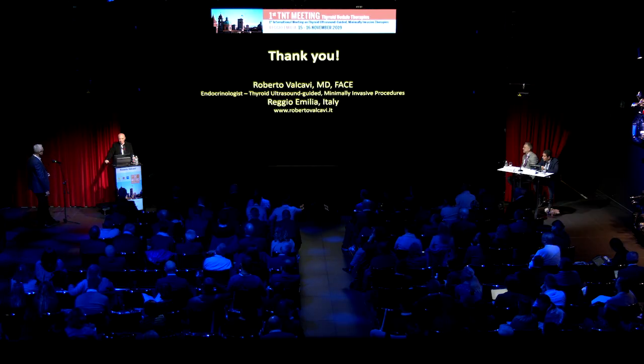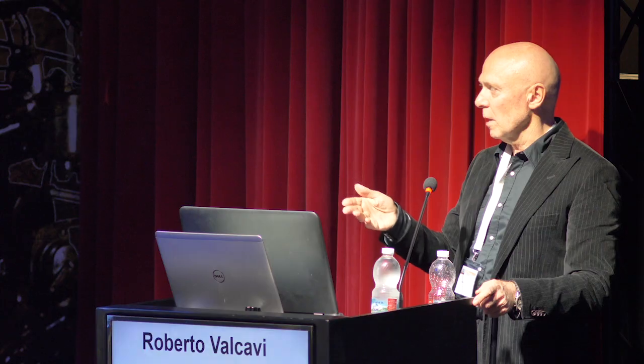Well, I didn't see any particular difference due to the extent of the cyst. First, make sure that you drain the cyst. Drain all of the cyst, not leaving any fluid behind.